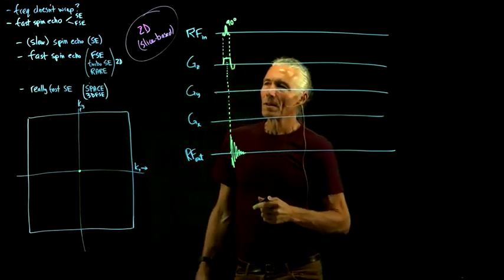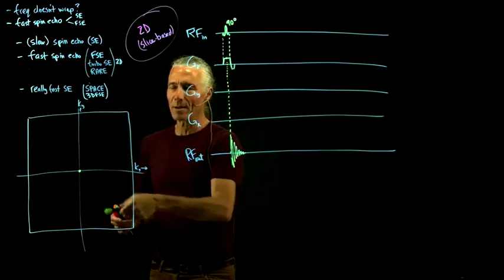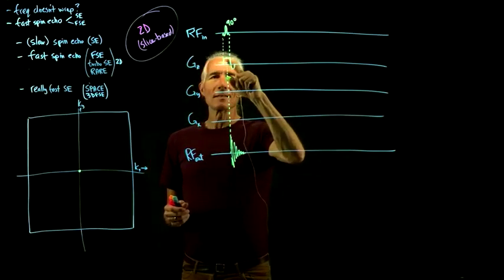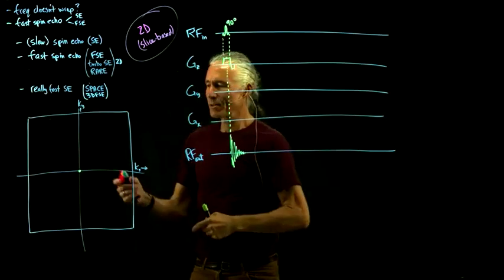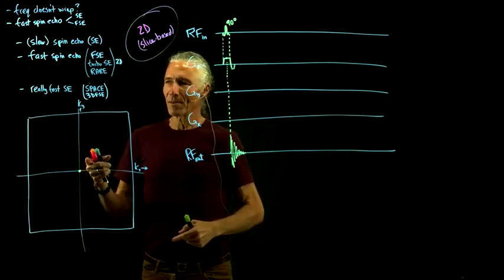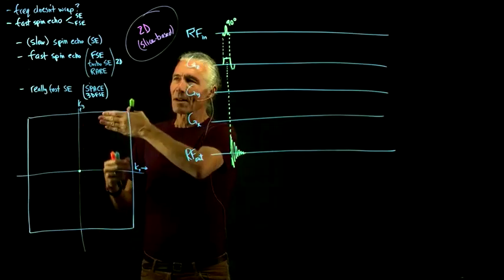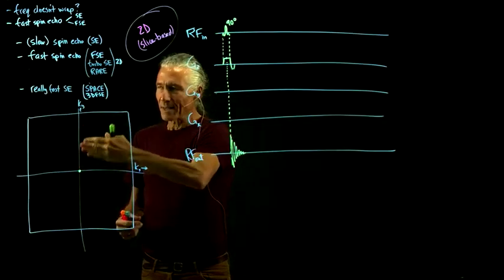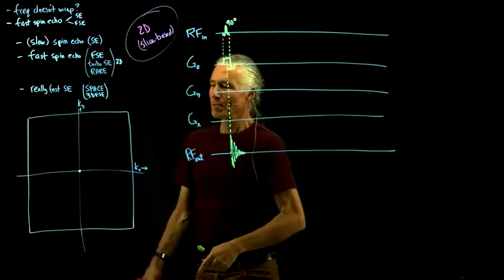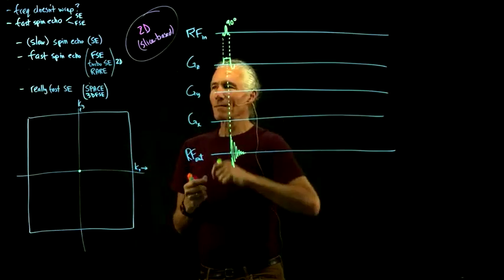because that's the zero of k-space. There are no stripes in the X or the Y direction, and also not in the Z direction. But then immediately we've got a gradient on. What's that going to do? It's going to cause stripes to appear in the third dimension of k-space, striping in this direction, actually coming out of k-space, which isn't even visible on this diagram because I just drew the X and Y part, but there's a Z part also. But then we quickly fix them.